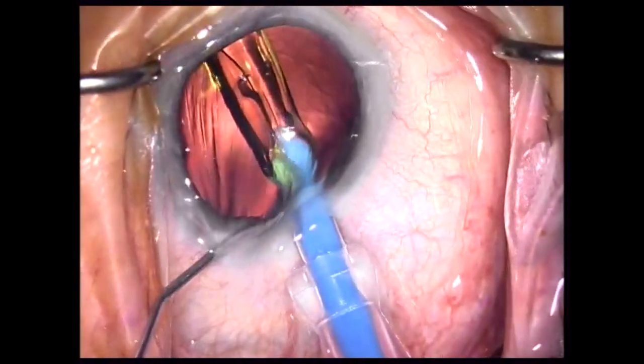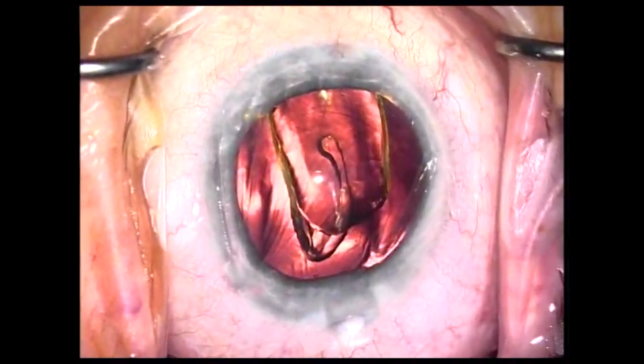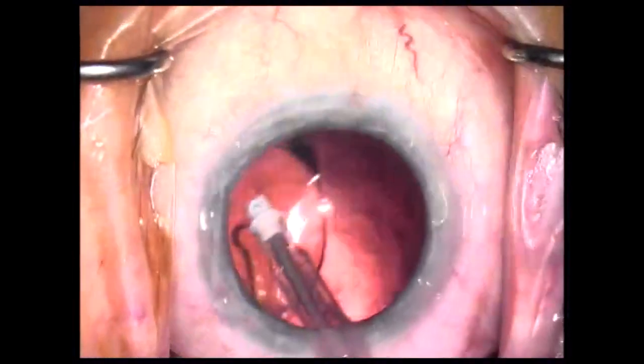One issue is that the trailing haptic often sticks to the optic and you have to apply a lot of force to get it off. Here's an example of that — you can see it's stuck and I have to stick the IA probe in and apply quite a bit of force to release it.